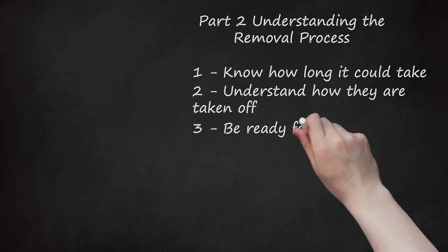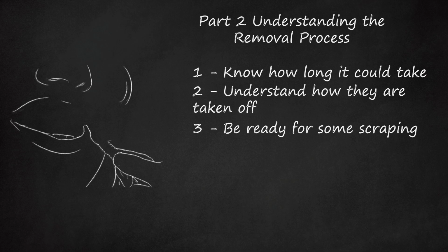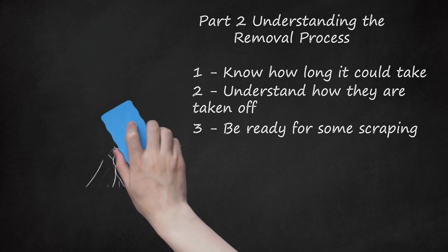3. Be ready for some scraping. After the braces are off, there will be some leftover residue of the glue or cement on your teeth. Your orthodontist will get to work scraping this off with a special instrument. Typically, this cleaning shouldn't take more than around 5 minutes, depending on how much glue you have on your teeth. Depending on your teeth, you may feel a little sensitivity during this process. You'll be desperate to see your new teeth, but be patient.